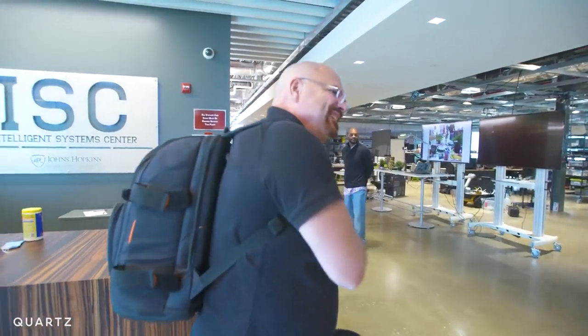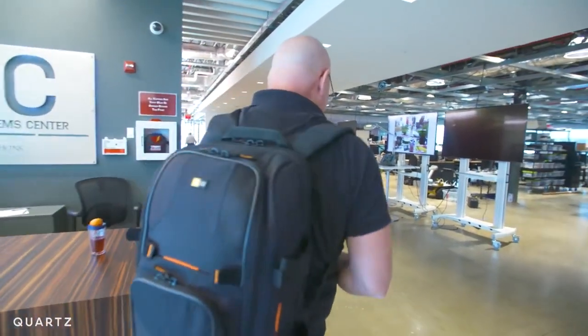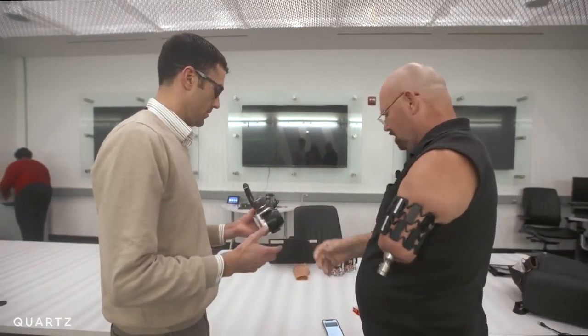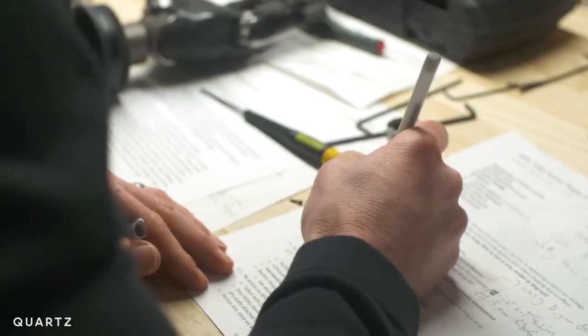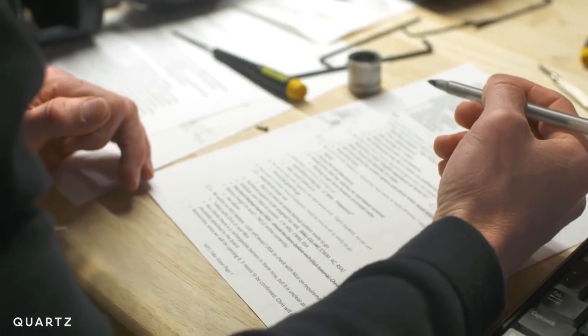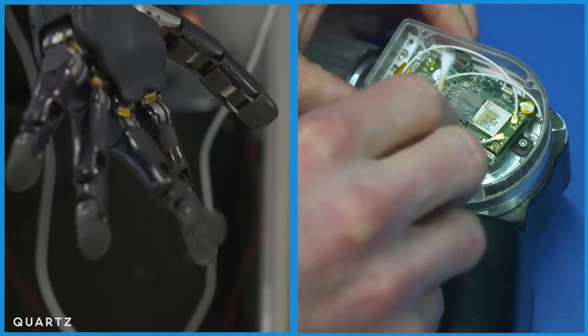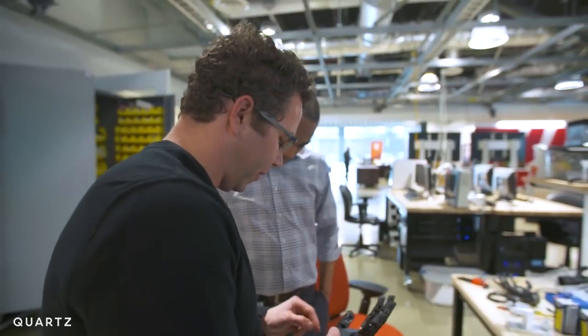So every 2 months, Johnny comes into the lab in Maryland. It's like being back home, right? He hands over his arm, almost like bringing a car in for a tune-up. We have a list of things that we want to get to, so we're just trying to adjudicate what we choose to do now and what we leave on the table for another time. To save time, engineers work on different parts of the arm simultaneously. Just do a once-over on all the fingers.